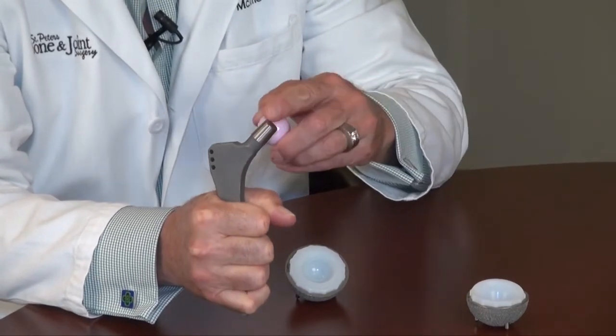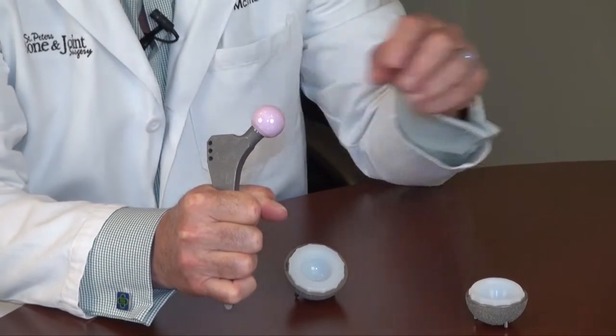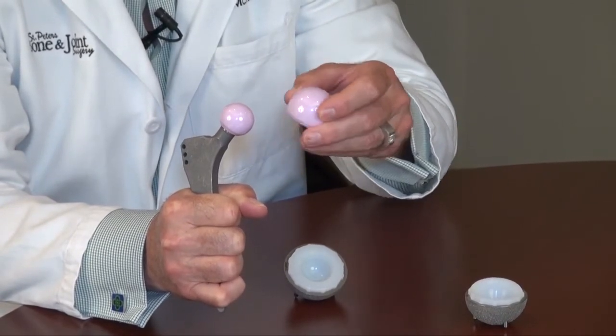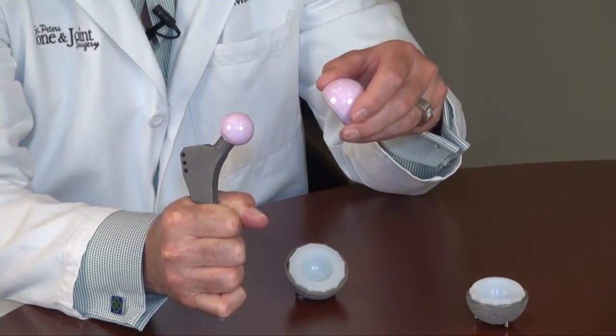There's a ball that fits onto the stem, and this is made of a ceramic. They're different sizes, and it depends on how big the socket is. We like to have a large ball because it's generally more stable, but we have to put it in according to how big the socket is and how big the patient is.